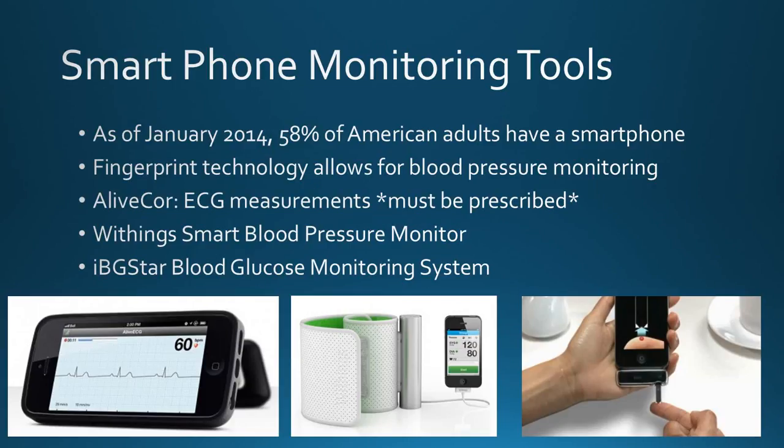And there's some fingerprint technology that's allowing for blood pressure monitoring on some of the phones I've heard. Again, that's probably not an accurate method because once you get into the fingerprint or fingertip area, it's got a huge variability, but it is something that I've heard from patients.